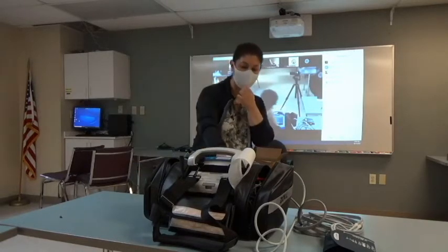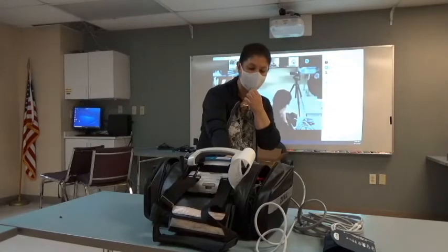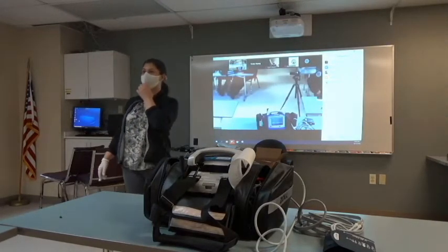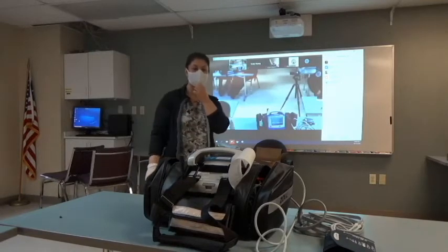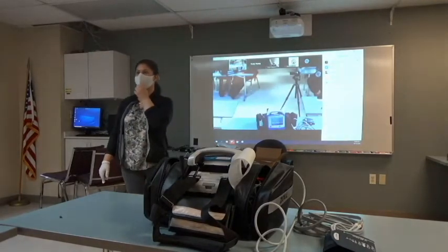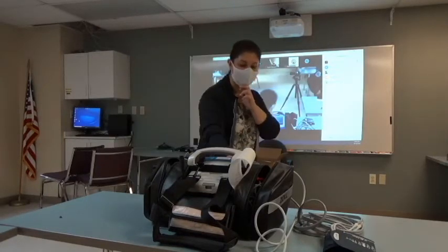Okay, I'm gonna hit my back arrow key. That back arrow key will take me out of my code markers. I'm gonna skip the sync button for right now. I'm gonna come back to it. The roll of paper just makes paper. That's all it does. It's just a start, stop, print. Which is my record button? The camera, very good. Hit your back arrow key.